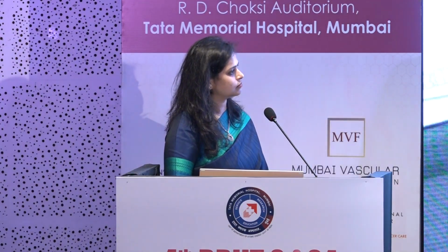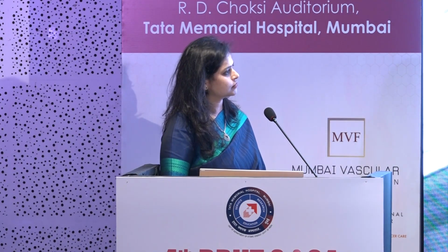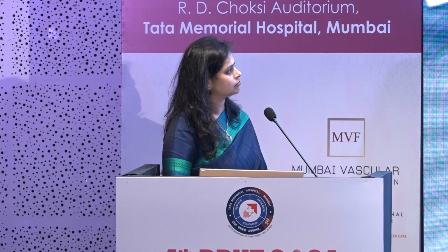So this is a medial and the... It needs to go into the groove on both sides, and then it has to click inside. Then it says sample for calibration, so we press the notch. Once the calibration is done, we know that the system is ready to use. However, by protocol, we always check the vacuum function as well before going on with the biopsy. Right.